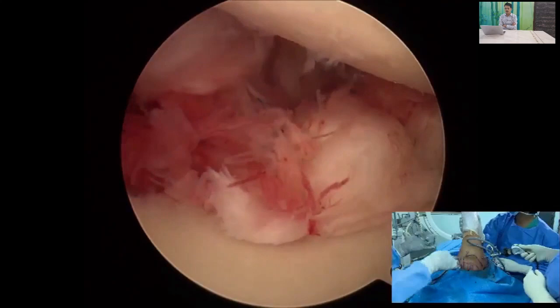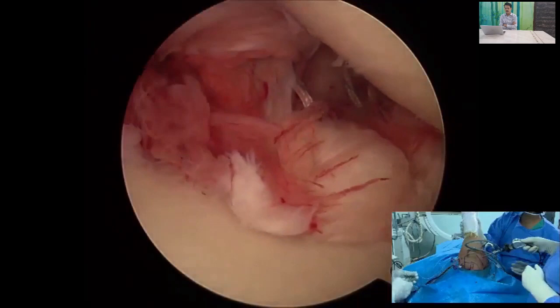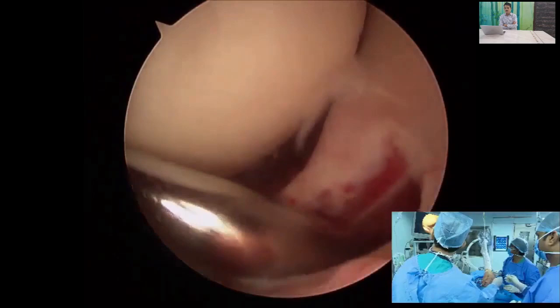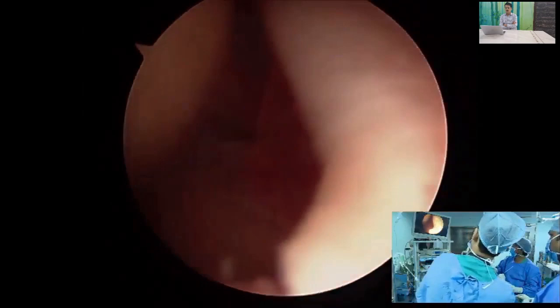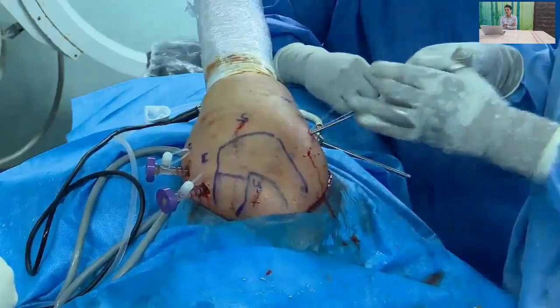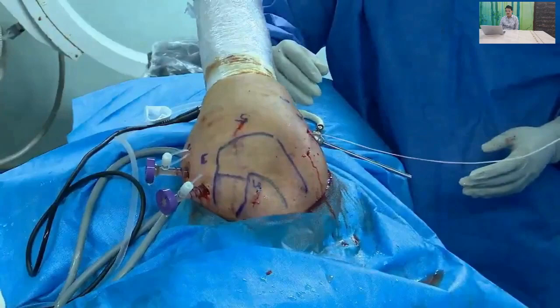Insert the scope to assess the reduction. You can see that the humeral head, which was previously subluxating, is now well reduced and centering nicely over the glenoid, with a solid capsulolabral repair of the anteroinferior labrum. Finally, tie the remplissage sutures from outside, taking care to avoid skin dimpling. If you have any questions about this repair, please leave them in the comments.